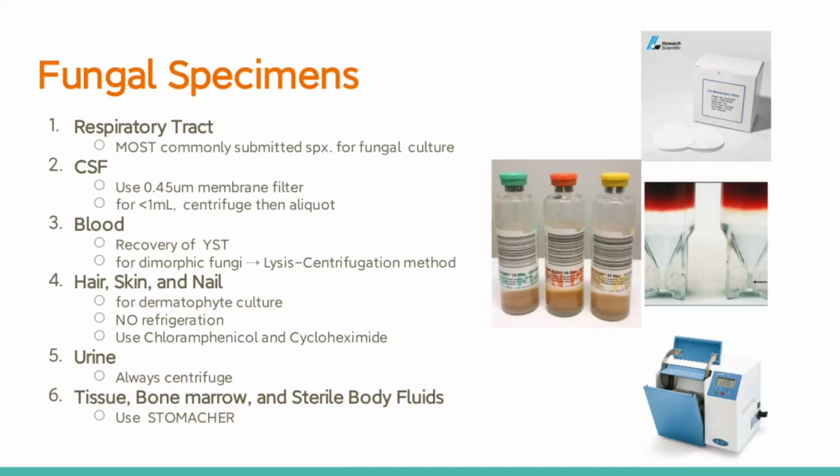That's their mode of transmission. That's why the most common specimen for fungal culture would be the respiratory tract. And remember, I'll write it here: BAL or bronchoalveolar lavage, what is that for? Pneumocystis jirovecii.